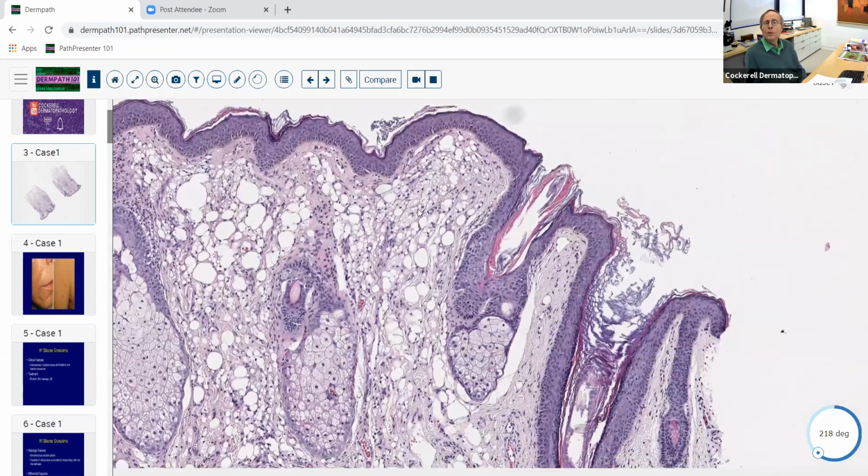So you can get clear as a consequence of lipid. Histiocytes or cells that have a lot of lipid in their cytoplasm can give you a clear color under the microscope. If there's a lot of glycogen, that can also give you a clear color under the microscope. Glycogen is often within epithelial cells.